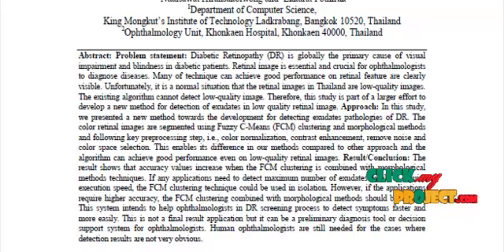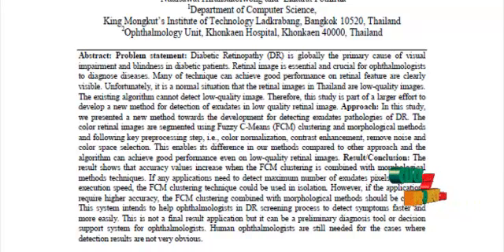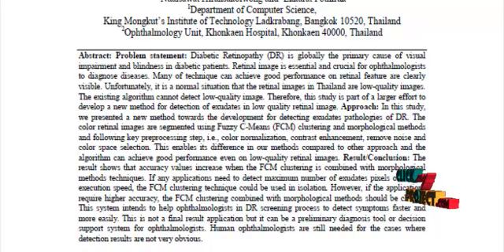Finally, we are measuring the accuracy, sensitivity, and specificity of the classifier, and the results are displayed.